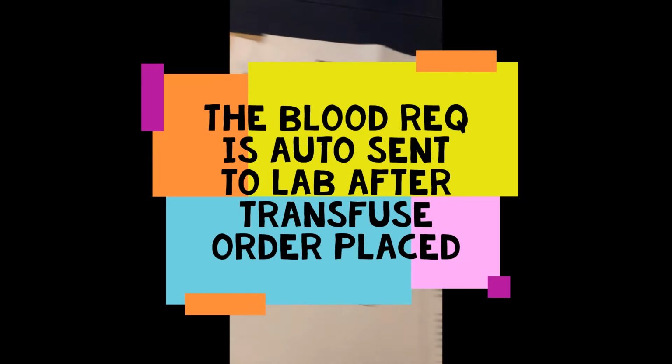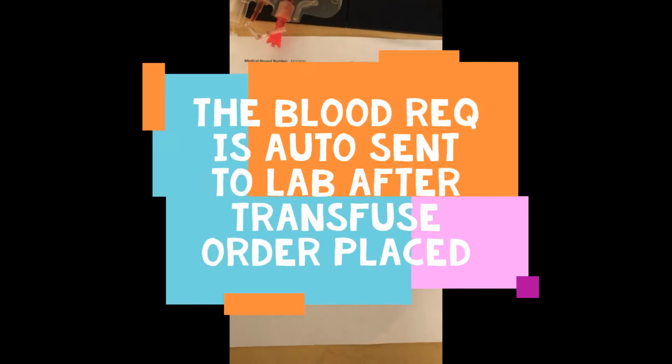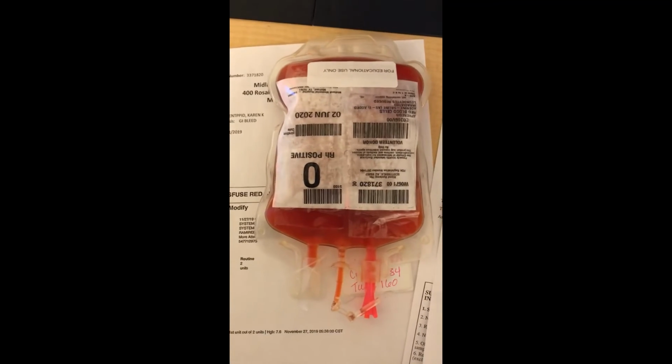After that, you want to make sure that you send off for your blood requisition. After that, you would receive your blood product, which would look like this. On your blood product, you're going to get 3 sheets: your product administration cheat sheet, your patient education, and your transfusion tag.